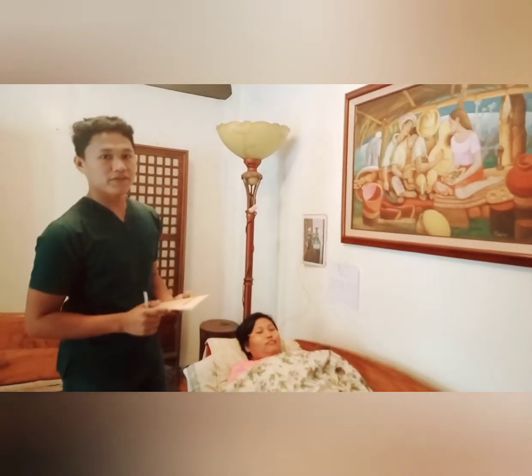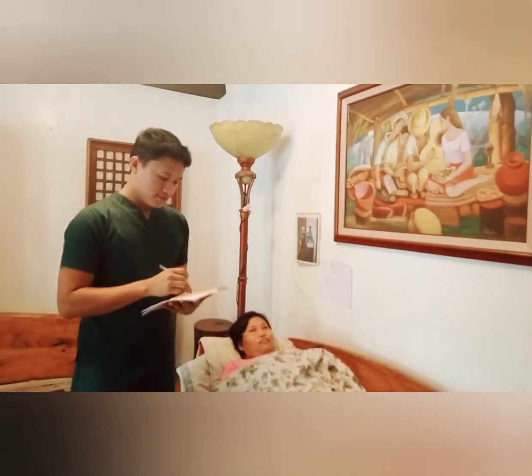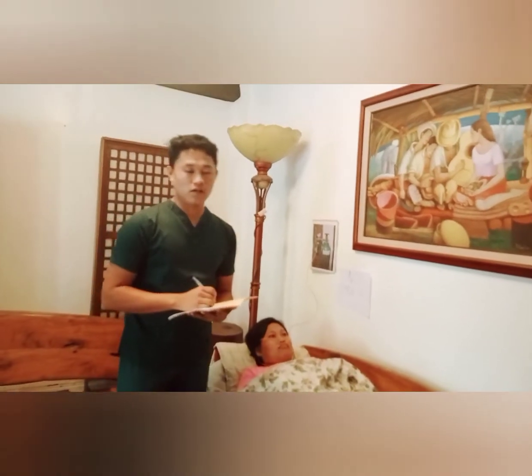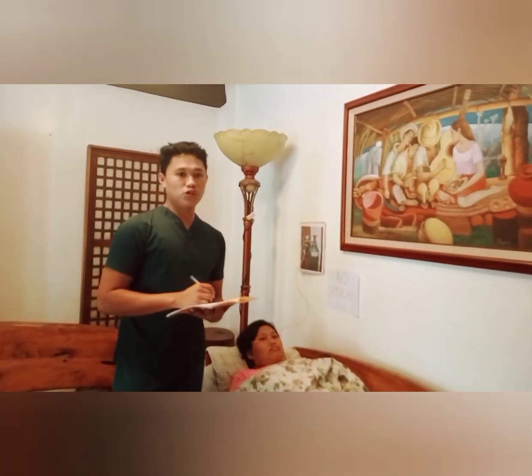So next is documentation. We are going to document the time, date, method, flow rate, and respiratory condition and response of the client to the oxygen. Documentation provides coordination of care, and also we are going to sign the charts to maintain professional accountability, and inform senior staff of any abnormalities or condition of the client to provide continuity of care.